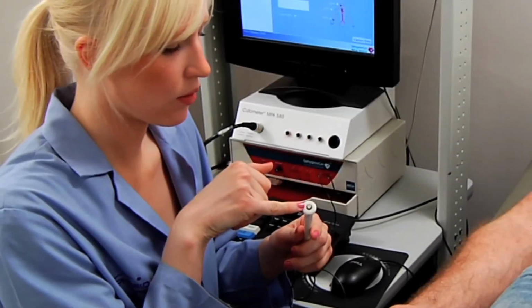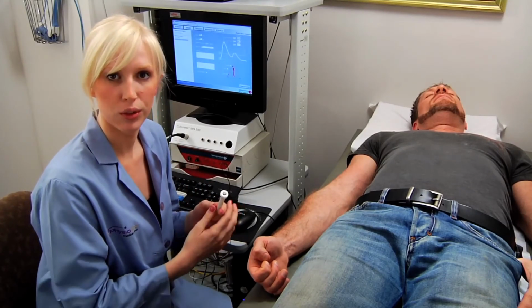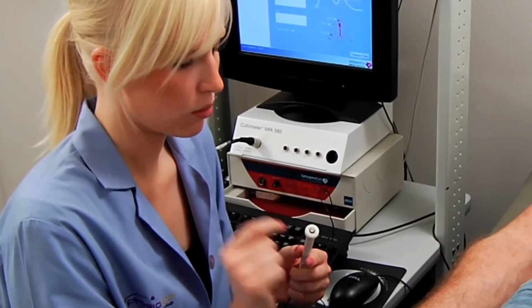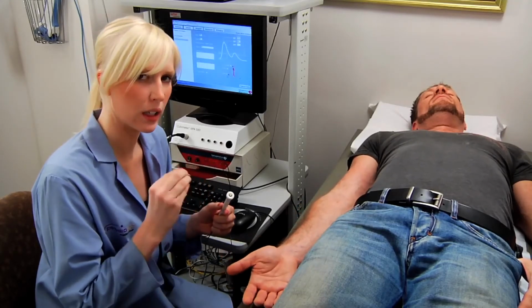This probe has a sensor. It's very, very sensitive. Again, it's also very sensitive to being damaged. So you want to be careful with this. You don't want to slam it around. You want to take good care of it. Keep in mind that there's this big section, but really that middle section is what's going to be doing the measuring. So that's the part you want to get on the pulse.